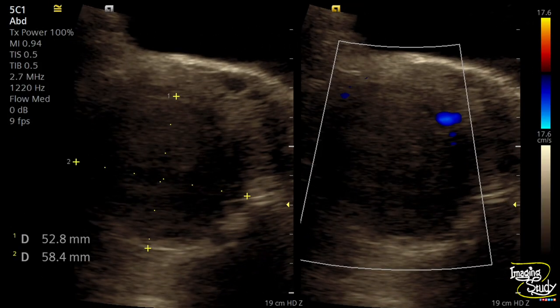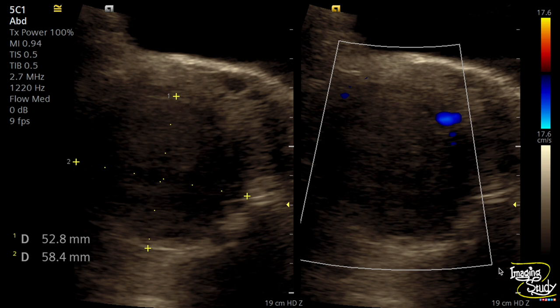Here is the measurement of the fibroid. If you check carefully, this hyperechoic thin line is the pseudo capsule, which is well visualized at the anterior part. On color Doppler, you can see predominantly peripheral flow.